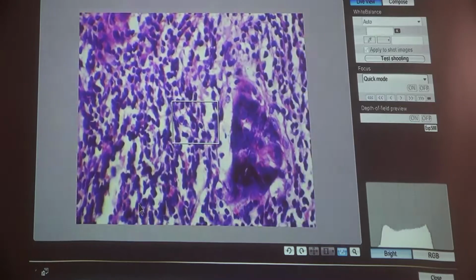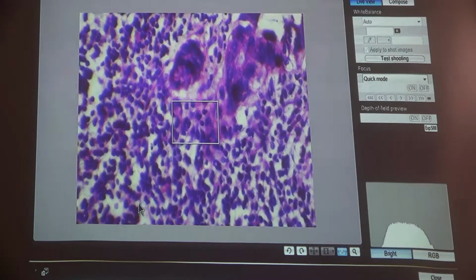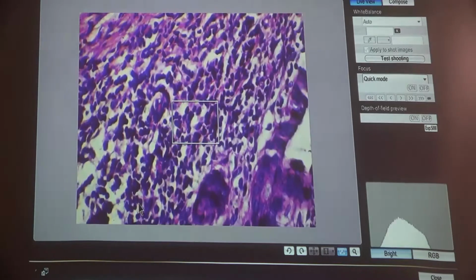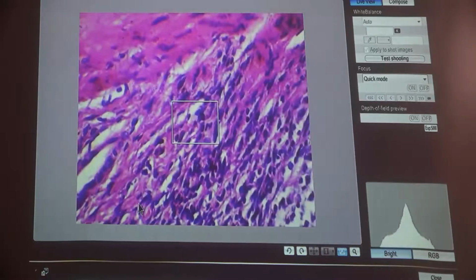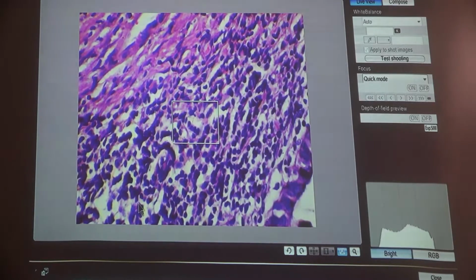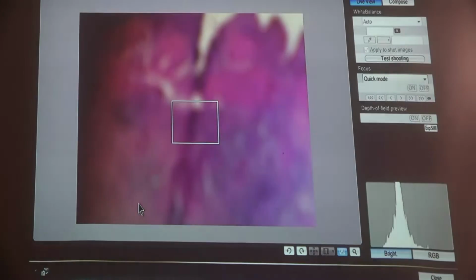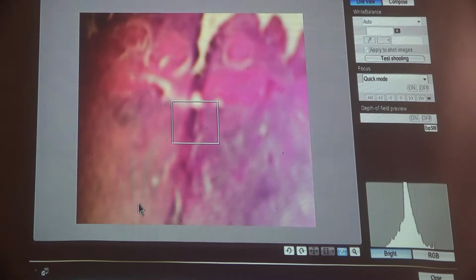These cells are remnant of destroyed glands. These are not giant cells, but benign looking mucosa. Benign looking mucosa entering the submucosa or the muscle layer is also called Rokitansky-Aschoff sinuses.